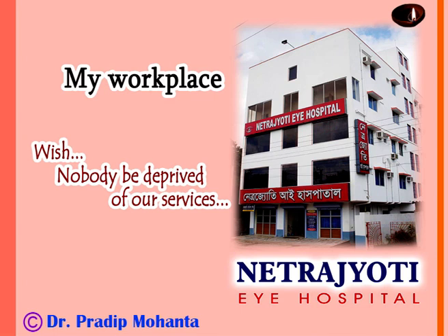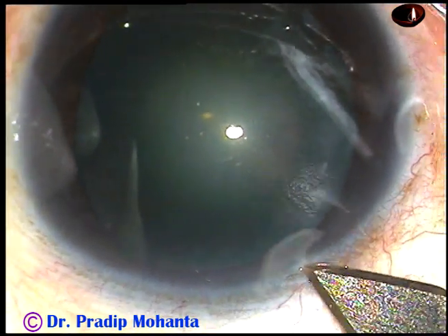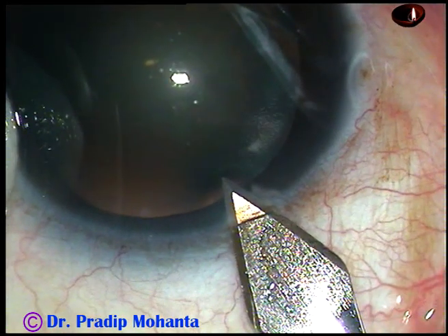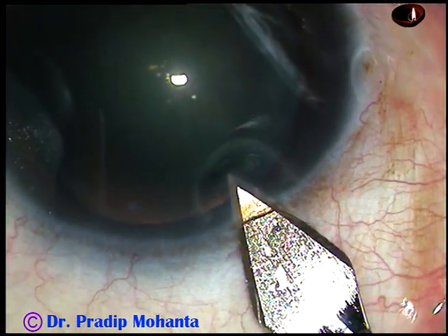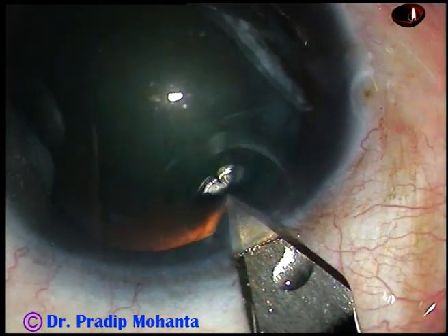Dear colleagues, welcome to my hospital at Ranaghat, West Bengal, India. This is a soft cataract and in this case I have employed the carousel or the cartwheel technique for management of the nucleus. Let us see how the surgery goes.